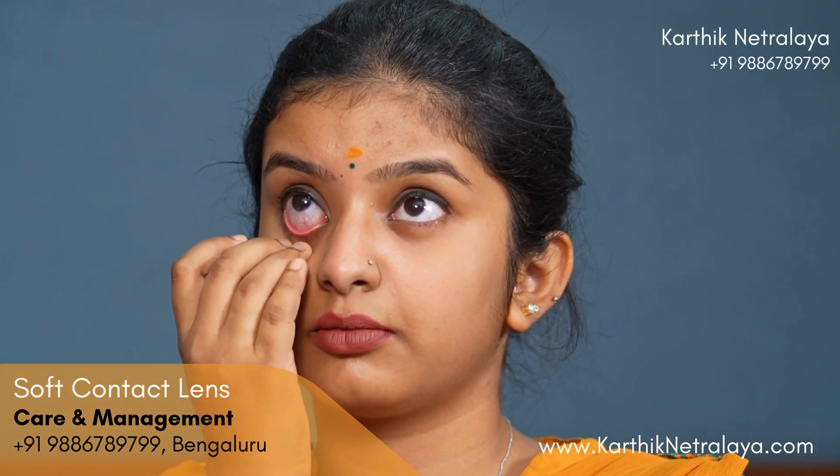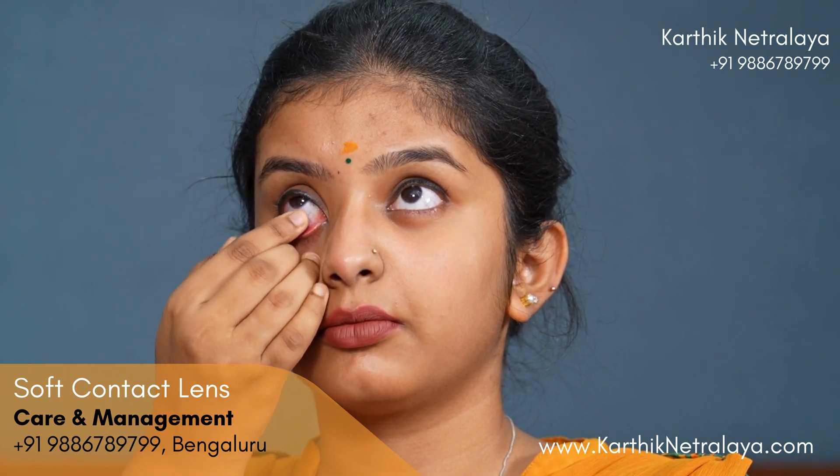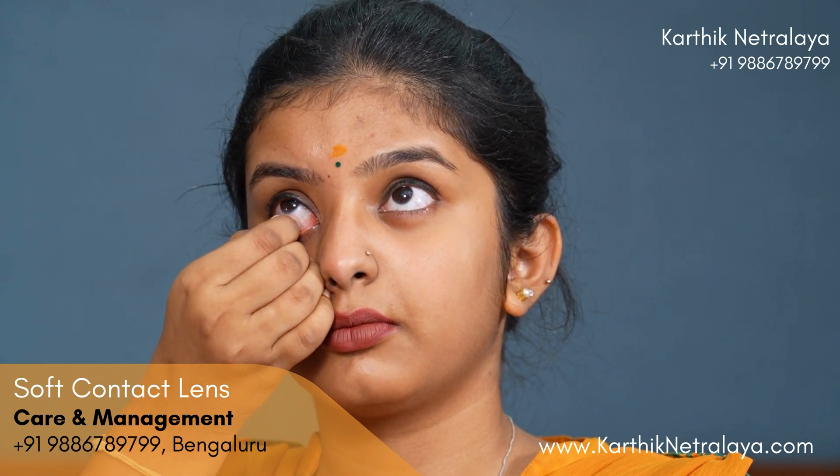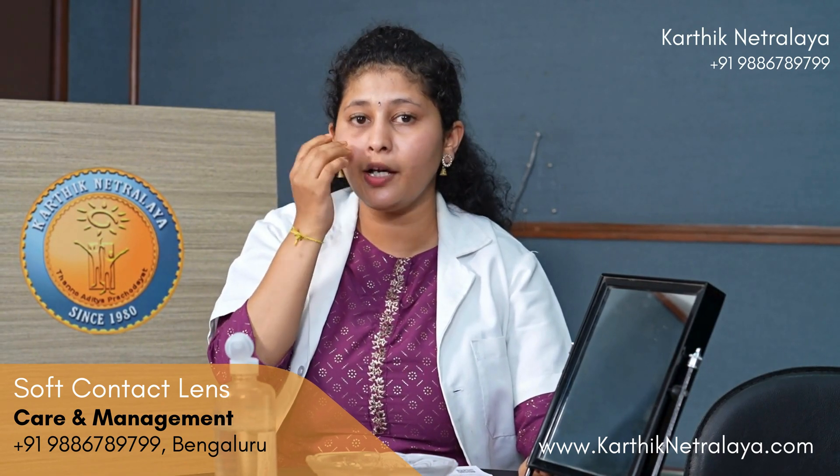Insertion and wearing of the lenses are done. Now I will teach how to remove the lenses. Look completely upward, then use your index finger to pull the lower lid down and pinch the lens. When pinching, make sure the lens is in the white portion of the eye — do not pinch when it is on the black portion. Always pull down first, then pinch. If the lens is not coming out, pull and then pinch again.